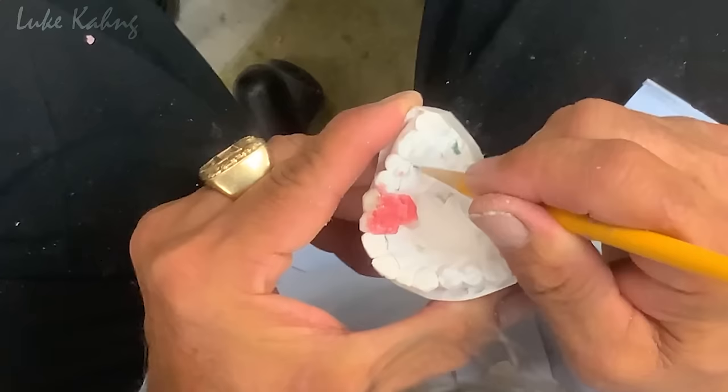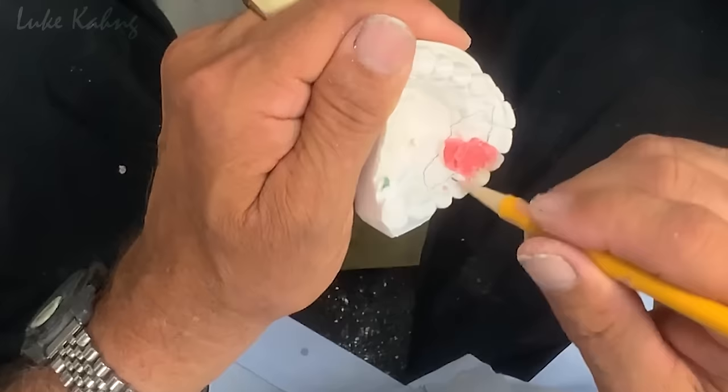Clasp here. What do you think? We'll double clasp here, but single clasp here. Okay. That's going to be too long. And do one here.